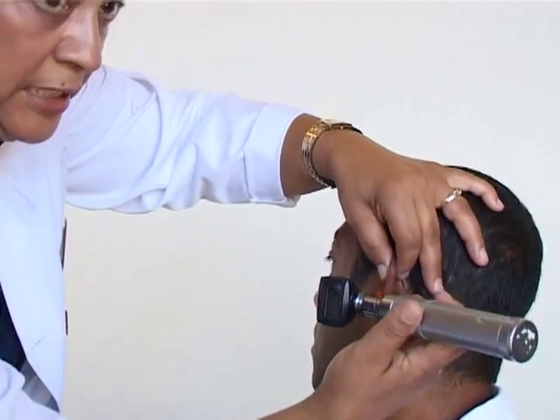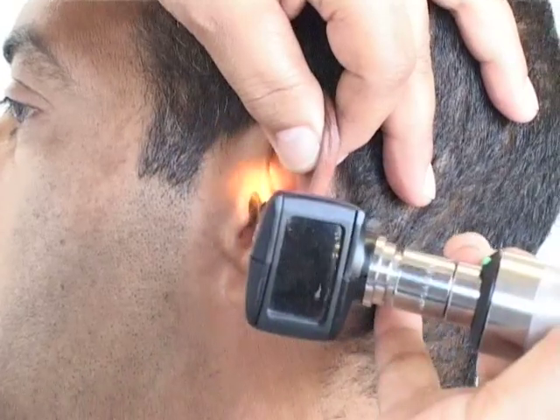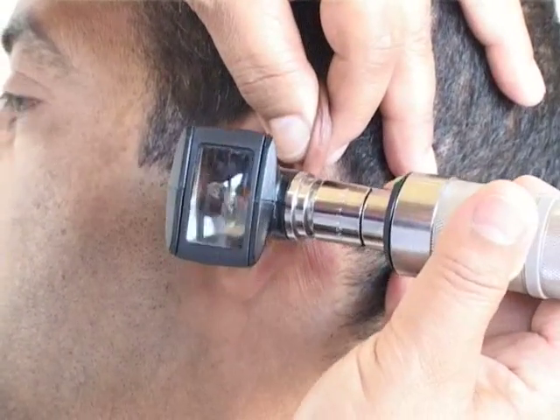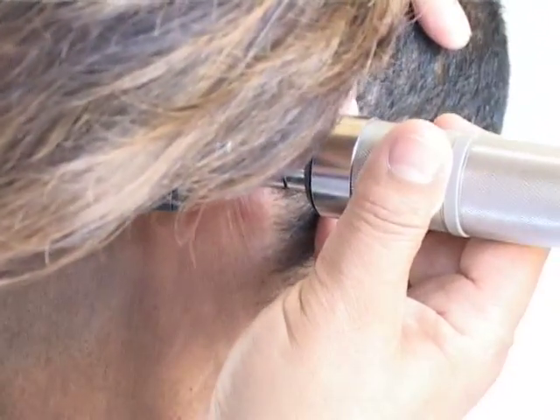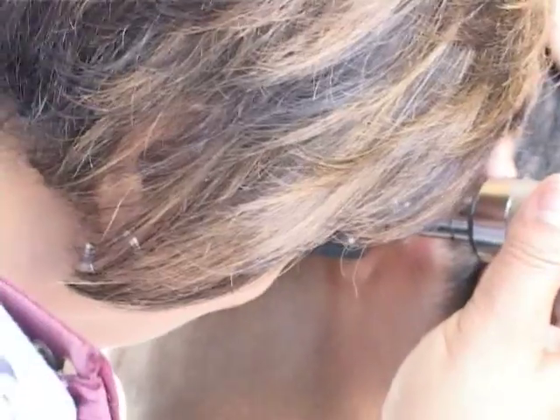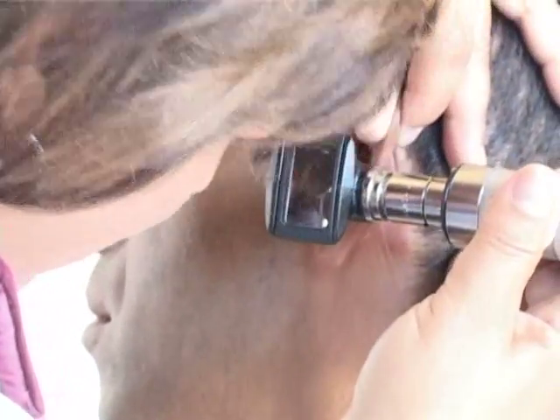So, as I said before, carefully, and we inspect. And after you find your findings, we take it out and we tell the patient what we have found.